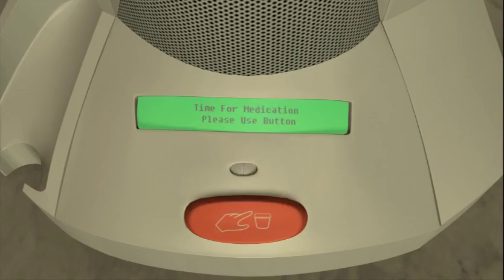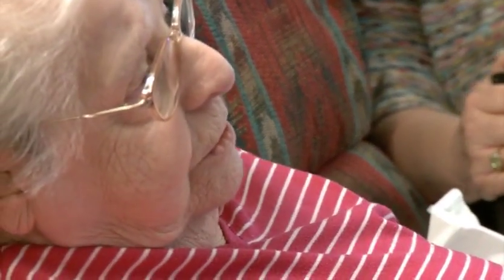Hello. This is the med dispenser calling. Your patient has missed their medication. This alert allows the caregiver to step in and resolve the situation properly.